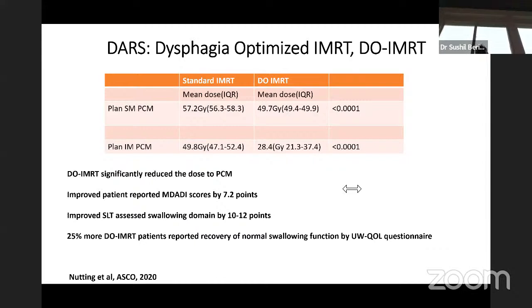Otherwise, with swallowing, you can miss the target. Especially with VMAT, the treatment time is short. With IMRT, the treatment time is long. Most of the time, when people did dosimetric studies, they found that the amount of time the larynx was outside the volume was small. But when the treatment time is short, it can become a significant percentage of it. So ask the patient not to swallow, and also use the auto flash module if you're treating early stage laryngeal cancer and the disease involves the anterior commissure.